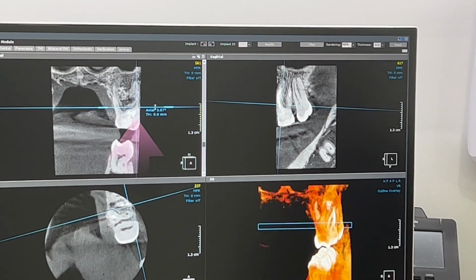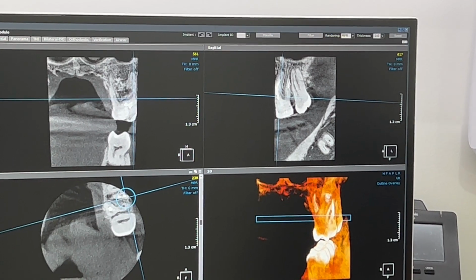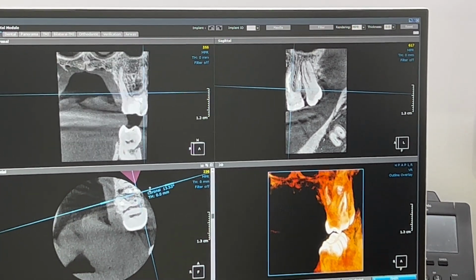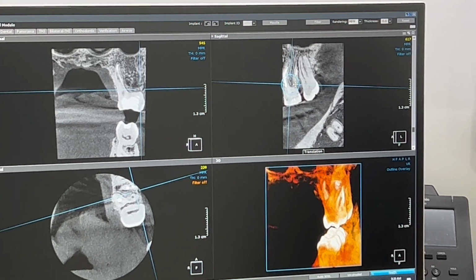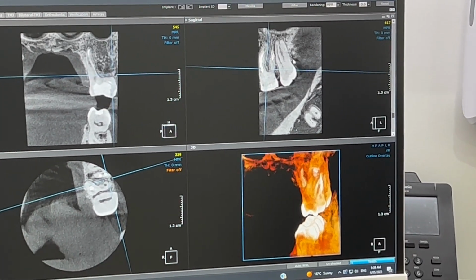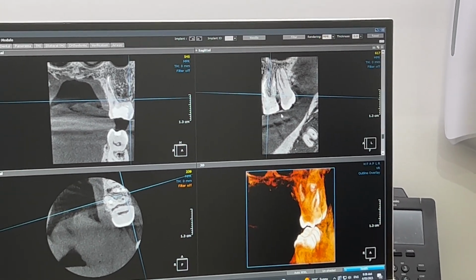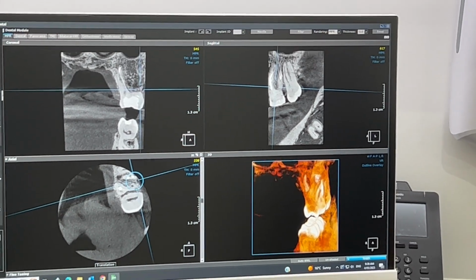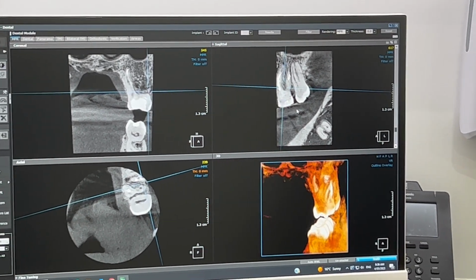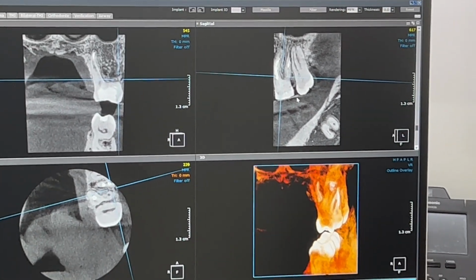And as you can see, the dentist has found really well all 4 canals, even an MB2, and navigated and treated them quite well. A few months of pain after the case, and they couldn't work out what was going on, so they went back in, opened the tooth up, removed the distobuccal canal, and probably about 7 or 8 sets of PAs later, they still couldn't work out what was going on.